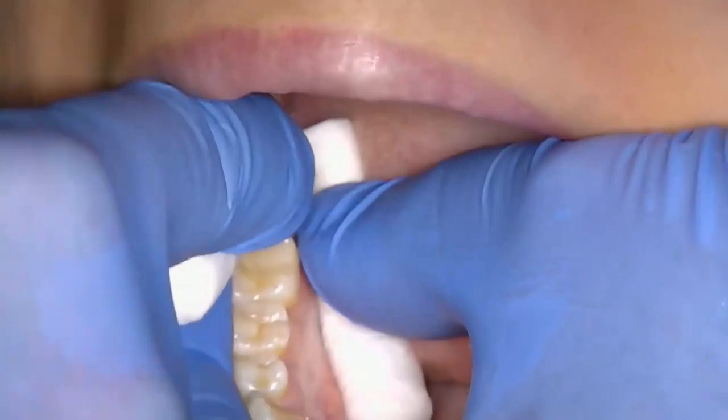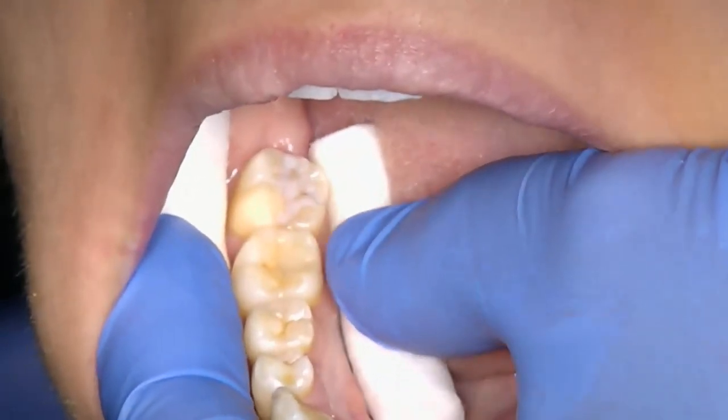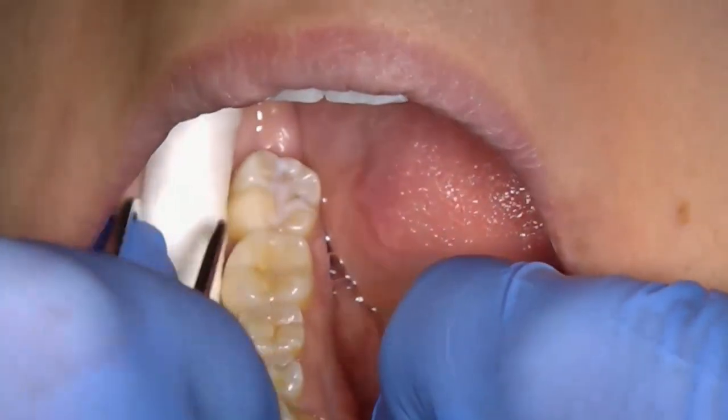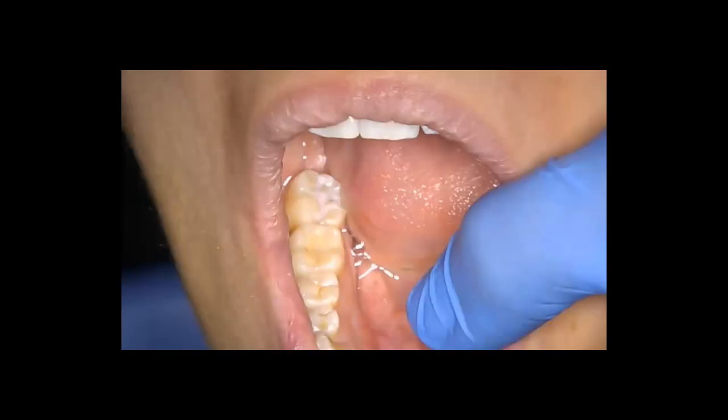Once satisfied that the fissure sealant is correctly placed and properly bonded, use a damp cotton wool pledget to remove the sticky polymerisation layer. A small layer of toothpaste can be smeared over the fissure sealant to help lessen the taste of the new sealant. Remove the cotton wool rolls and let the patient rinse their mouth. Ask the patient to feel round with their tongue to make sure that there are no sharp edges or rough areas.